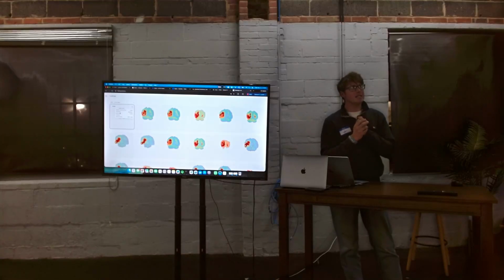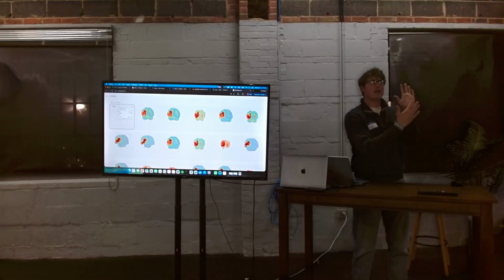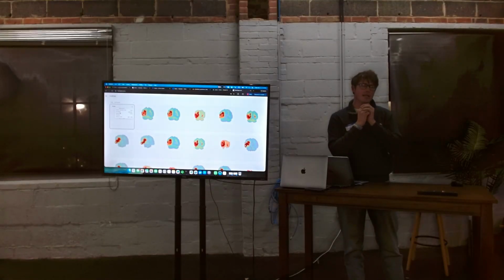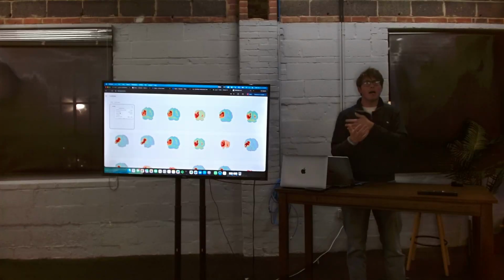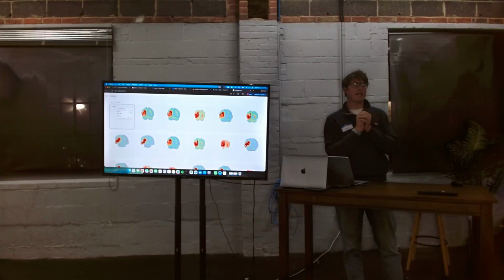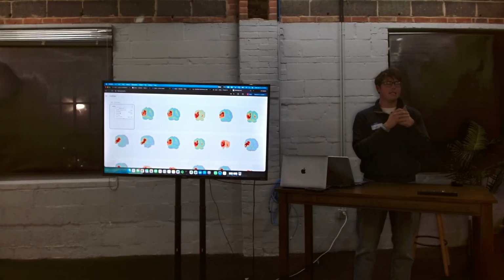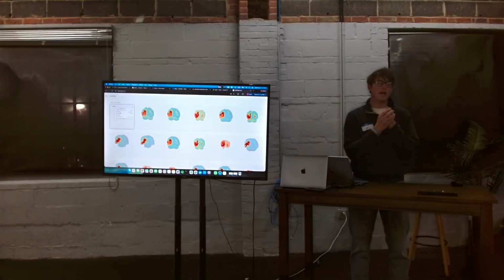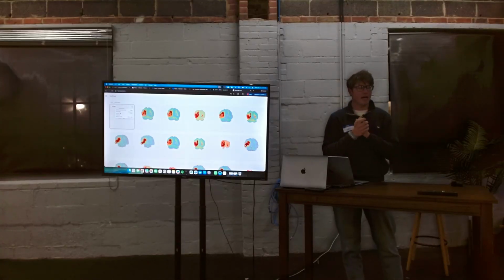I think the intent is to help people build machine learning models to automate segmenting their medical images. So yes, the intent would be for hospitals or researchers to use a platform like this, and then to build their own models that they then have to validate. If they were going to use it in a clinical setting, you would have to get it FDA approved. There's a lot of hurdles beyond that.